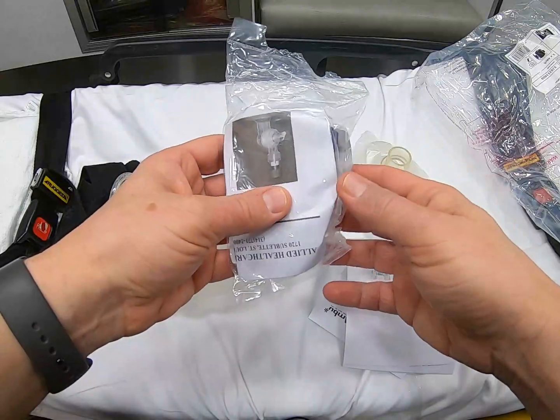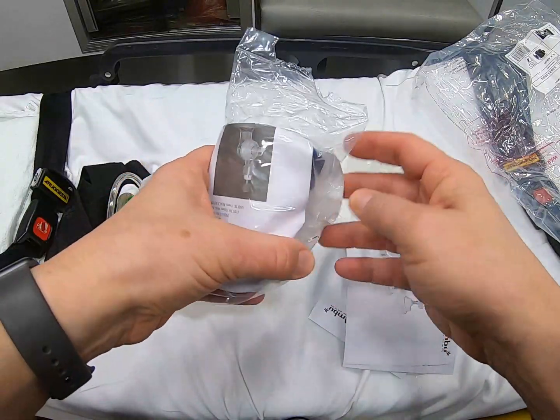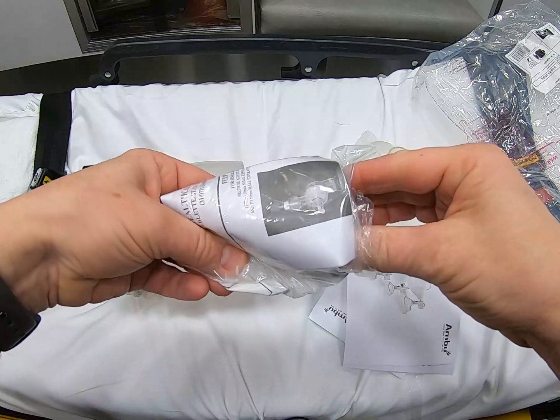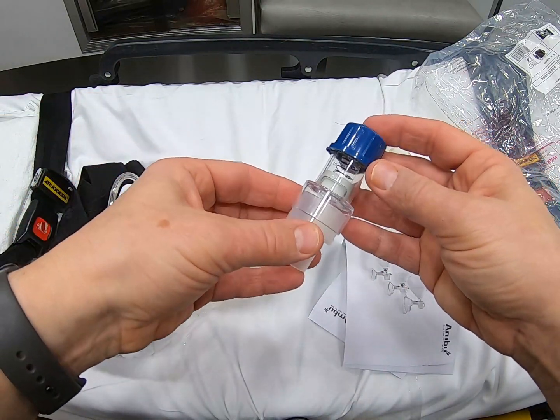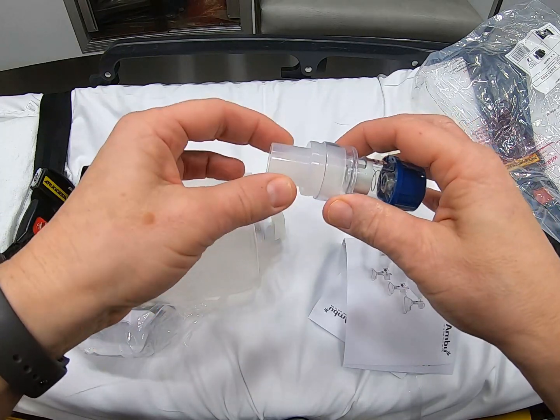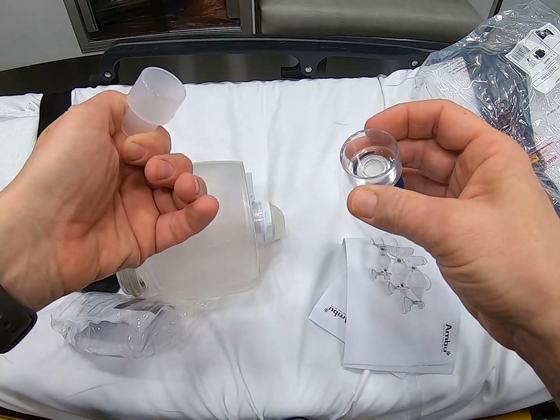The PEEP valve is going to be in a bag that looks like this. When you open up the PEEP valve, it comes out in a container like this. This portion here comes off and is disconnected.